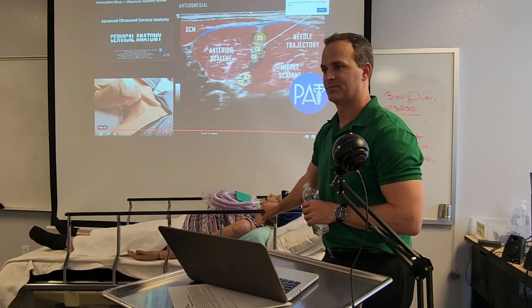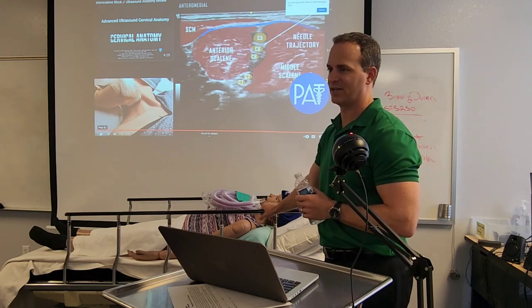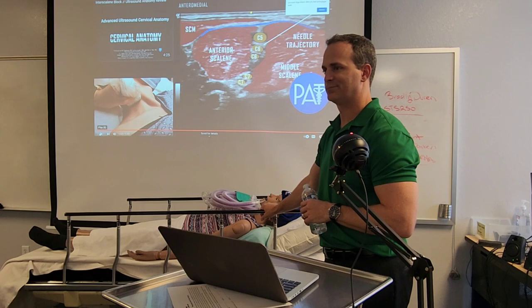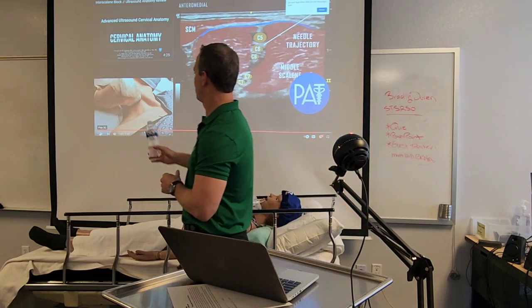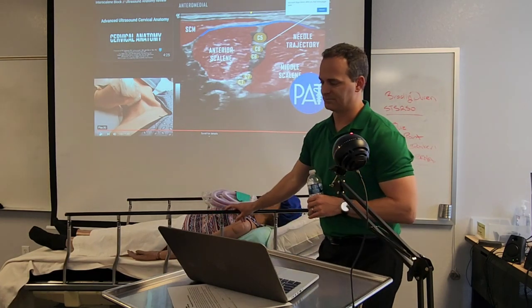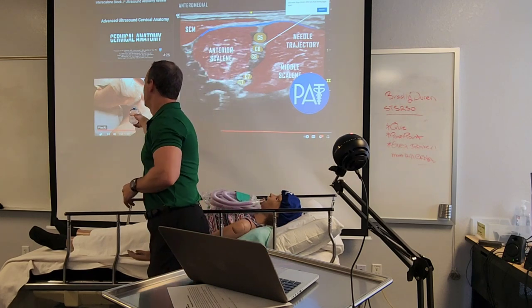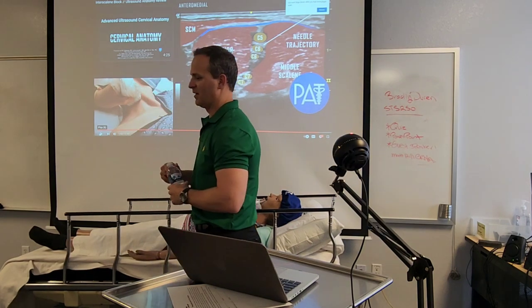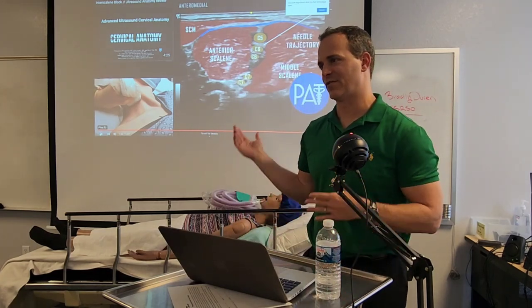What about like elbow surgery? Yeah, elbow surgery, surgery of the wrist, distal radius. Is that an endoscopy when you're on the needle so you know exactly where you're going? This is ultrasound. So this is our ultrasound probe here. It works via sound waves, and there's a computer off to the side that this is connected to that analyzes the sound waves and translates those sound waves into an image. So that's how we know like what it looks like and where we are.